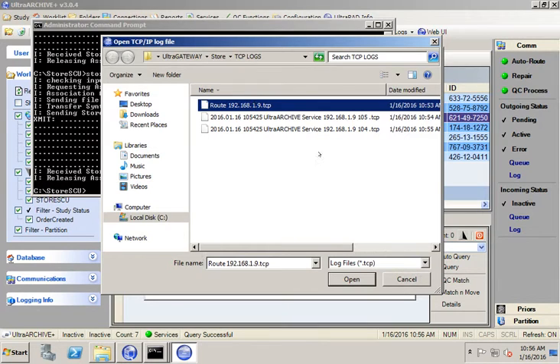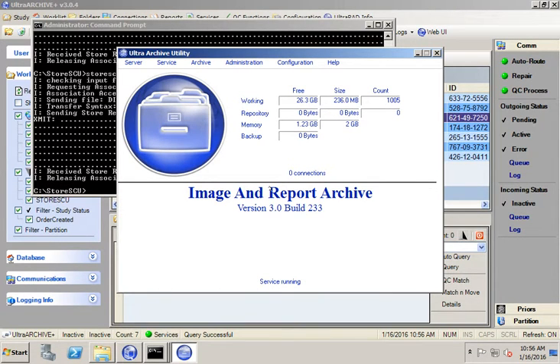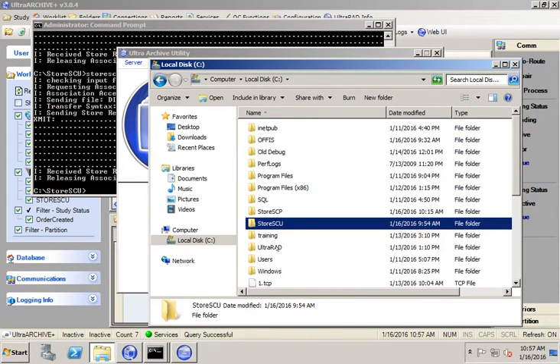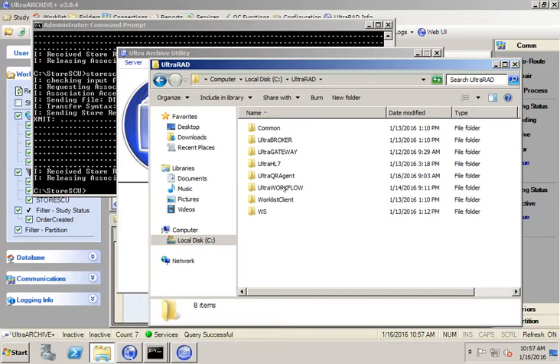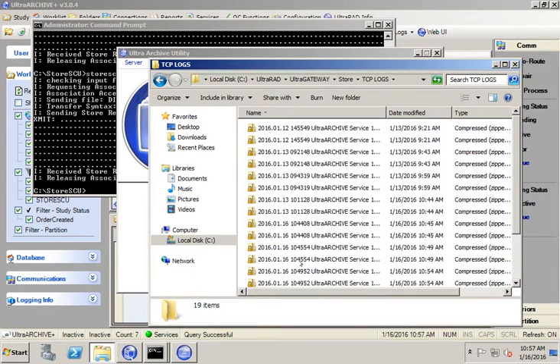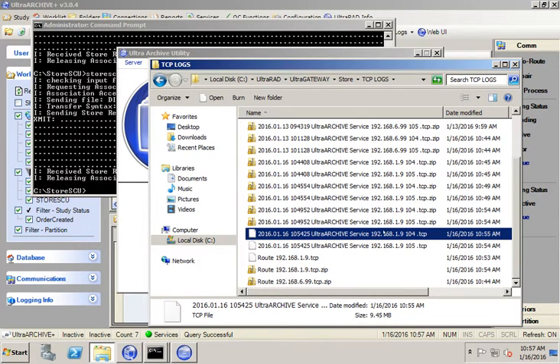Similarly, we also log when we're sending. So if you try to send a study, it'll show up in this log file. So if you're troubleshooting sending, use the route log file, and if you're troubleshooting for receiving, you're going to use the log file for the port number that you're receiving on. If UltraRAD asks you for a copy of the TCP log, you're going to find the log again, and if you go into your default directory where you're storing your DICOM data, you'll find the log files. So I'm going to go into my stored directory under TCP logs, and here's the TCP log that I would send to UltraRAD. So here's the one for port 104.